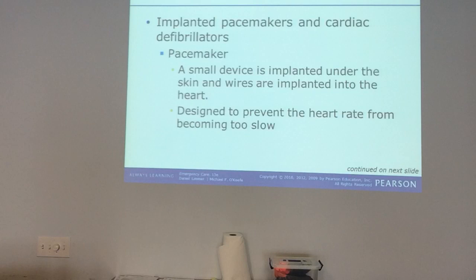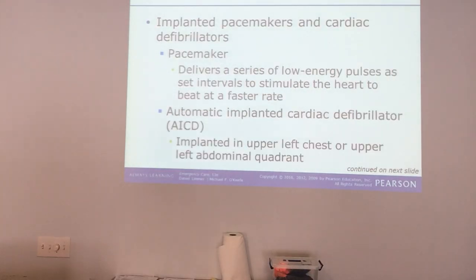Implanted pacemakers and cardiac defibrillators. A pacemaker is a small device implanted under the skin, and wires are implanted to the heart. It is designed to prevent the heart rate from becoming too slow. If Tabitha's here on one of our classes, we'll show you her pacemaker. She's our 30-year-old paramedic that got a pacemaker. It can happen to anybody, and they really do save lives. It delivers a series of low-energy pulses at set intervals to stimulate the heart to beat at a faster rate.